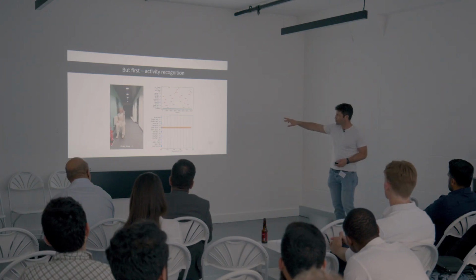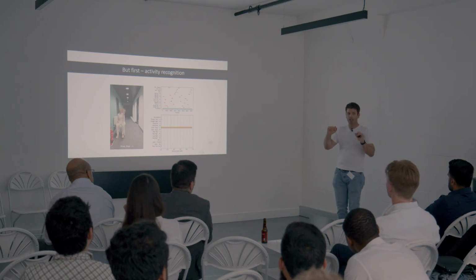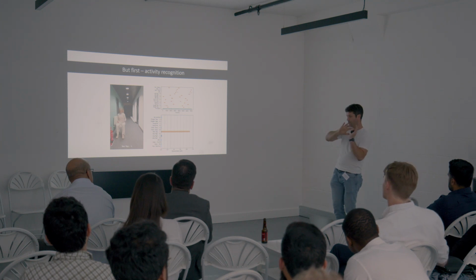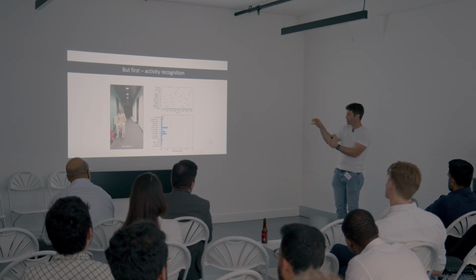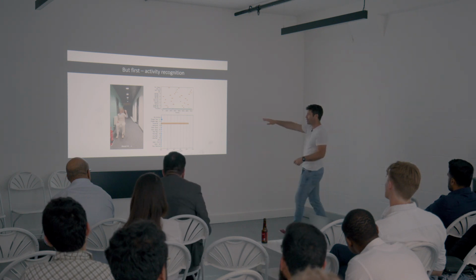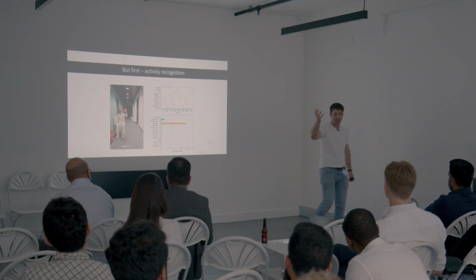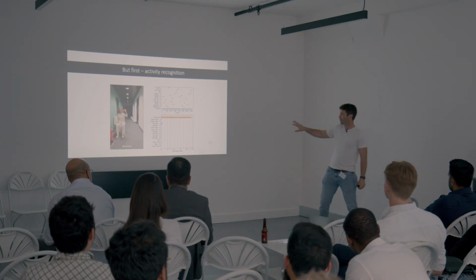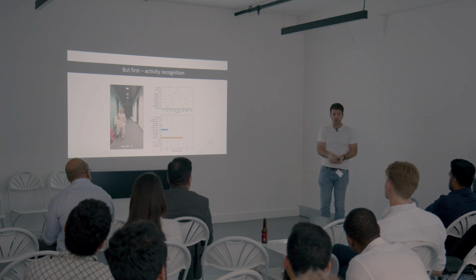So what we're trying to do here is recognize when the patient is undertaking one of those challenging exercises, so that we can, as it were, focus the light of the algorithm on that and gather that data in that information-rich time, when they're actually doing that activity. So for us, no action doesn't really mean they're doing no action. They could be dancing a jig. It just means that they're not doing something that we recognize as a physiological challenge to someone with Parkinson's disease.